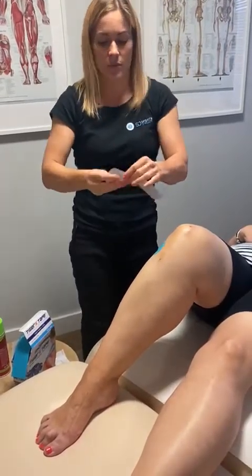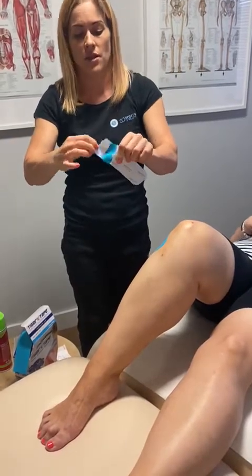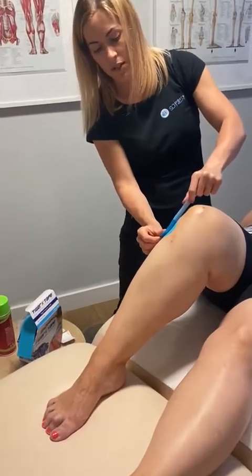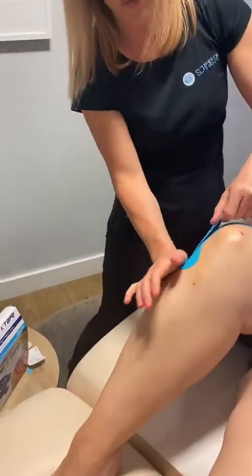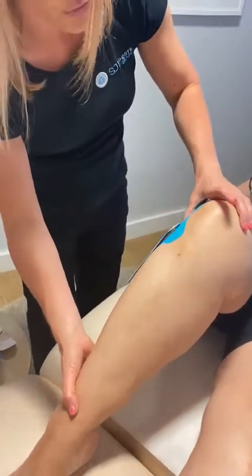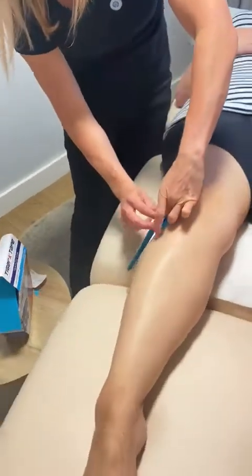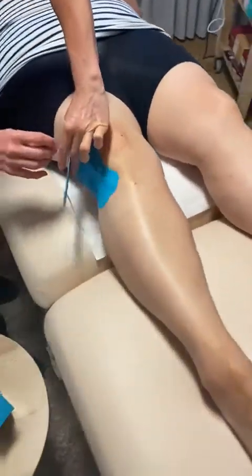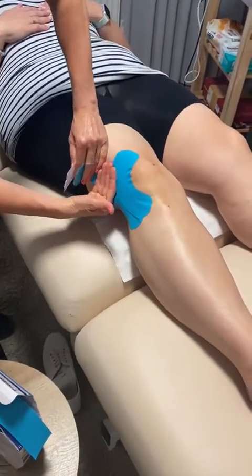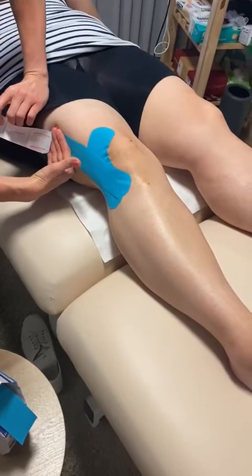Okay, and this time, we're going to peel off the end, so just peeling off the end strip, just like that, 1 square. We're going to pop that just over the top of that last piece we've got on the outside there, and we're going to rub that down. Okay, what we're going to do now is we're going to ask Donna to just straighten her leg. Okay, she's got a bit of tension on that piece there, and then we're going to just gently, again, 25% pull this up, and we've just got Donna's shorts here, so I'm just going to pop these up a touch and out to the side there, right up the thigh.